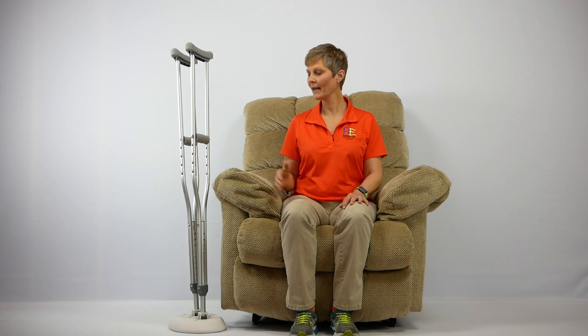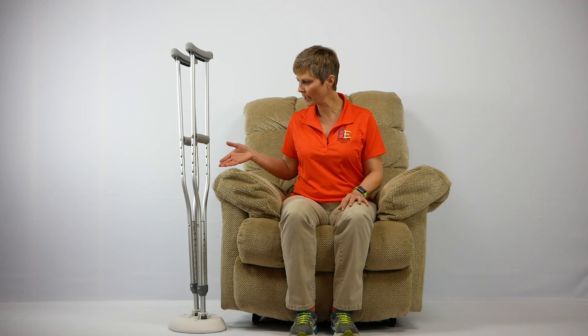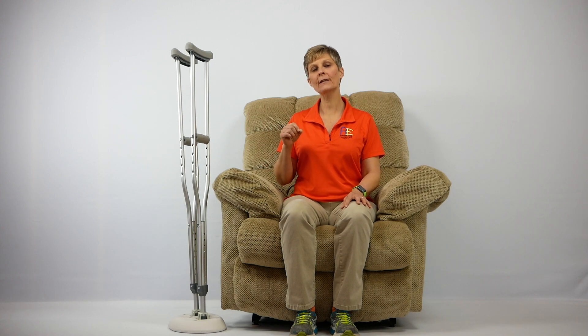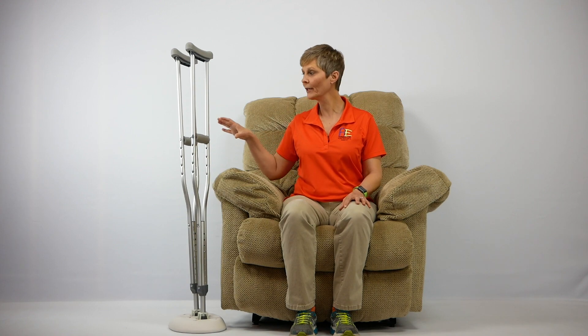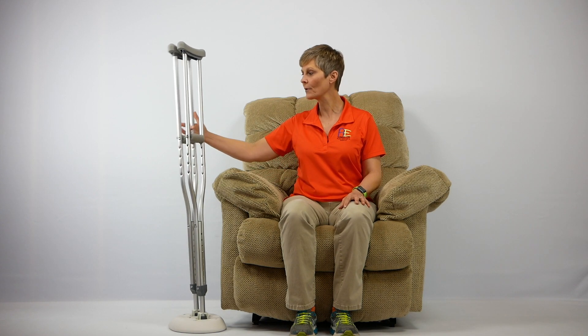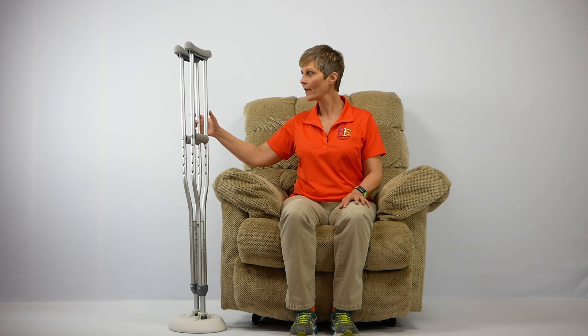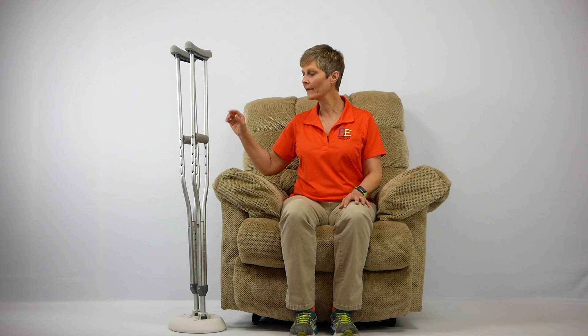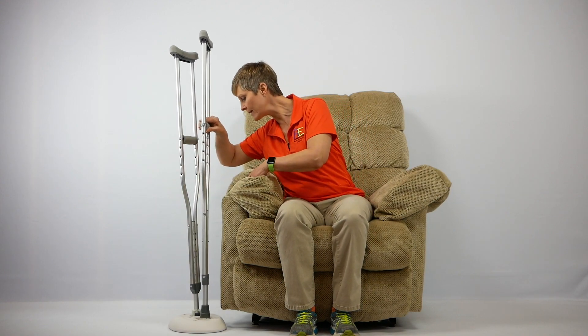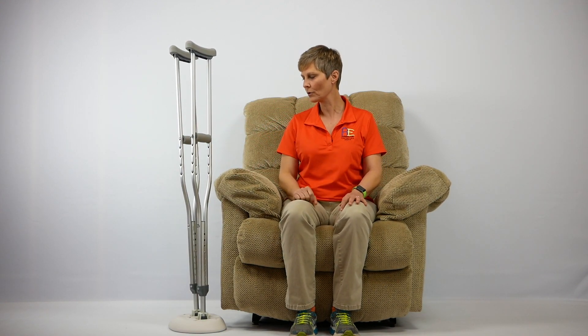So let's take a minute and see how the Crutch Caddy works. As you can see I have my Crutch Caddy sitting next to my chair. You could also put this next to your bed, or get two and have one next to your bed and one in your favorite chair — whatever works for you. I have to admit I was initially a little skeptical as to whether or not the Crutch Caddy would really hold the crutches upright especially if they got bumped, but I'm really quite impressed with how it holds them upright. I also like how easy it is to take the crutches in and out of the Crutch Caddy — it takes very little effort.